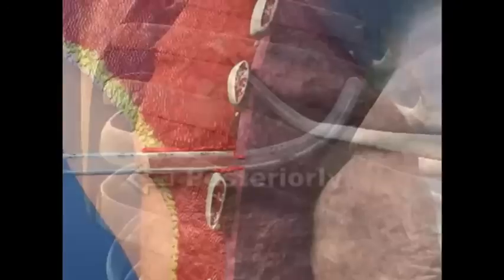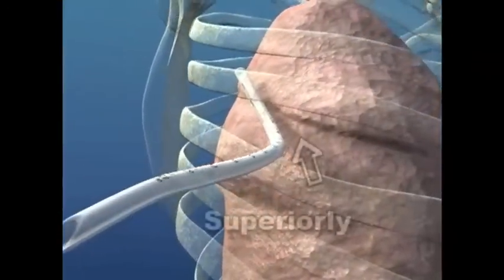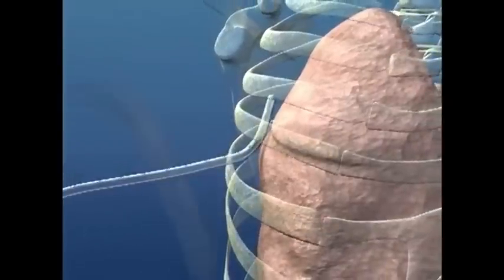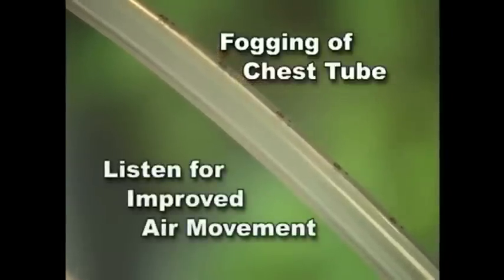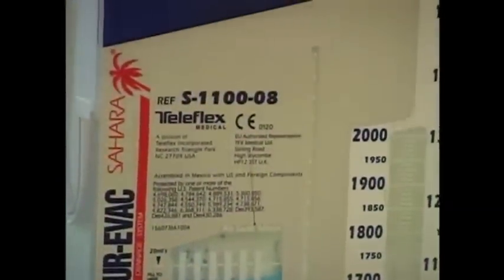The chest tube should be positioned posteriorly and aimed superiorly in the chest cavity. This will allow for maximum drainage in the supine position. It may be possible to see fogging of the chest tube with expiration and to hear improved air movement on the affected side. Connect the end of the tube to an underwater seal apparatus collection chamber.